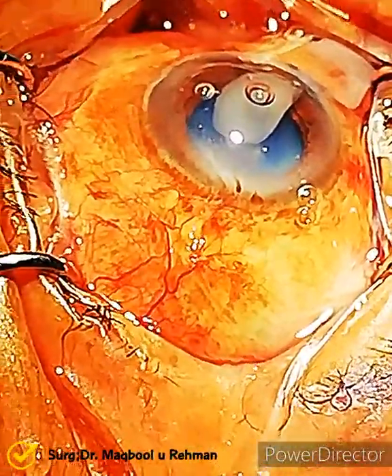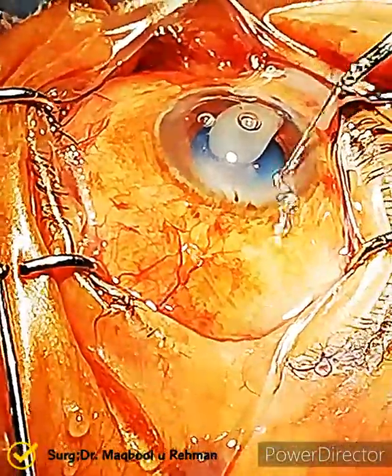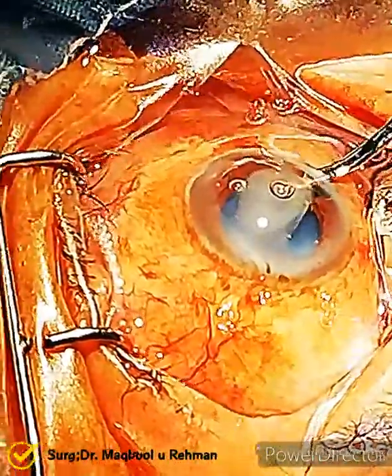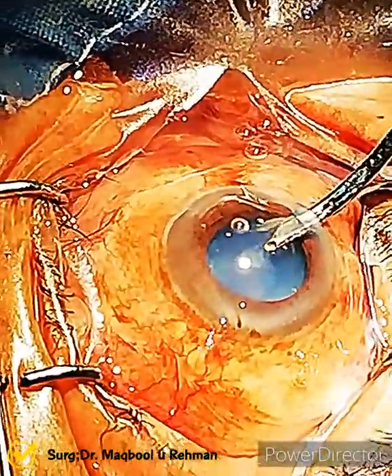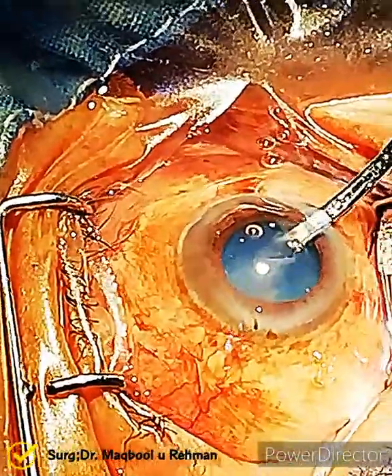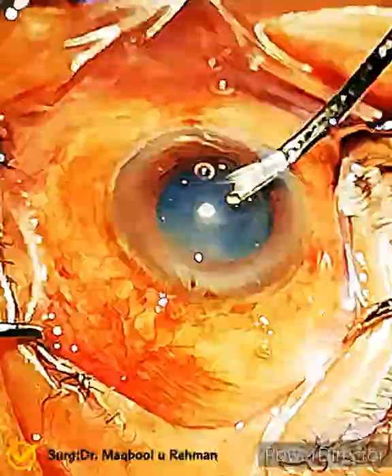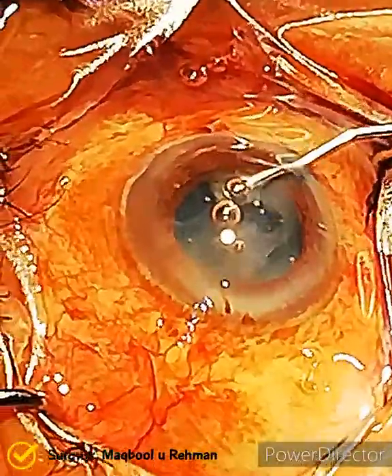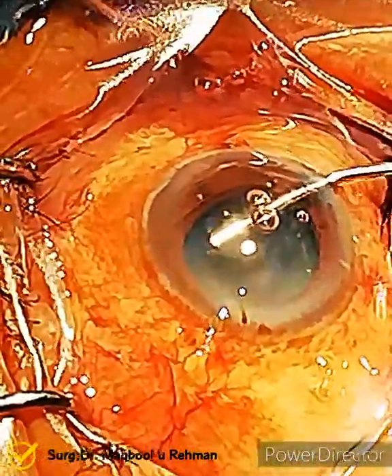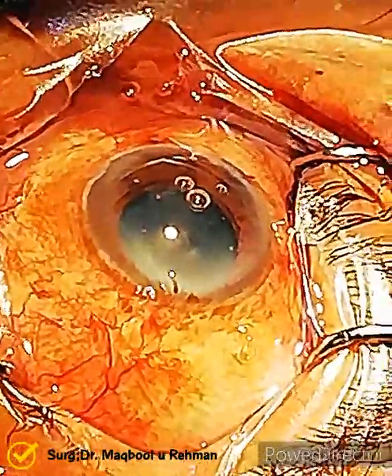Now the best step is to suck all the liquefied cortical matter through a simple cannula and decrease the pressure in the bag. The surgeon is doing the same, then putting some more viscoelastic into the anterior chamber to fill up the bag.